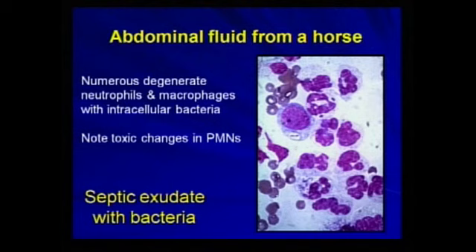You can see a neutrophilic specimen where the neutrophils are degenerate. If you look, you have hyperlobation here, or sometimes they will swell and you almost cannot see the multiple lobules, and that is toxic neutrophils. You can see that if somebody has tapped it and left it in the fluid too long. So I usually reserve the term sepsis or septic exudate for when I have identified bacteria as well.